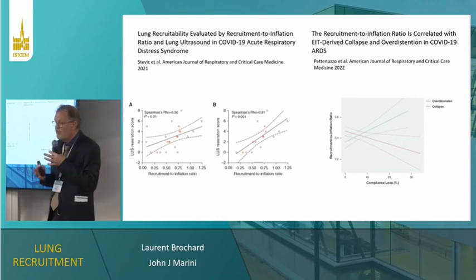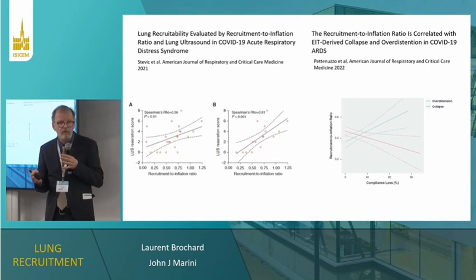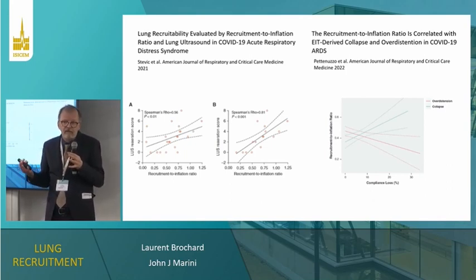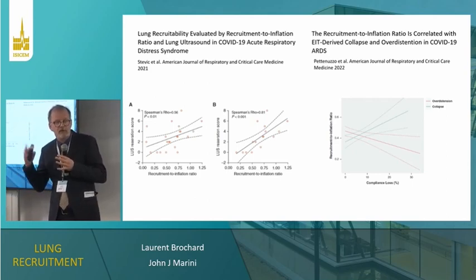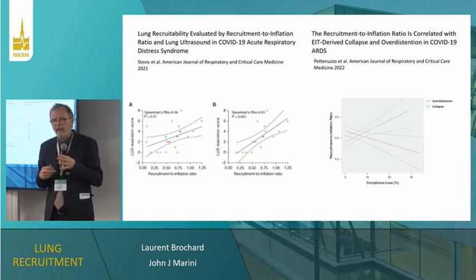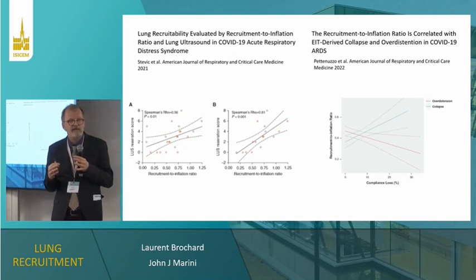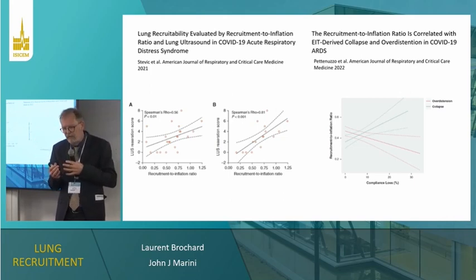There have been studies showing that it's reasonably well correlated with lung ultrasound. I think we need more data. Lung ultrasound is a very interesting technique, but it takes much more time to do a complete lung ultrasound examination at 2 PEEP levels. But it is well correlated, and also recently correlated with EIT. And there is a recent study showing also a good correlation with CT scan. So I think it's not perfect, but it's a reasonable technique.